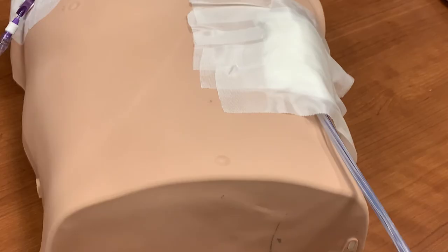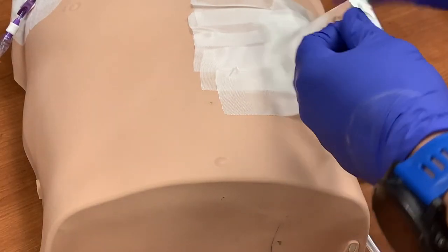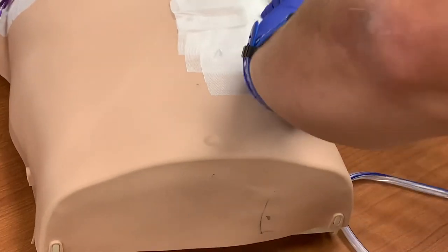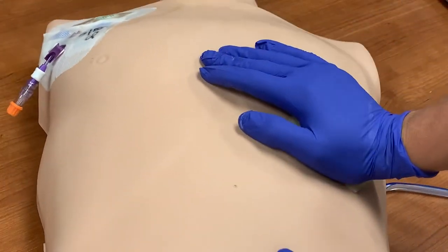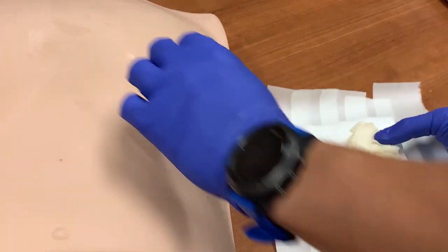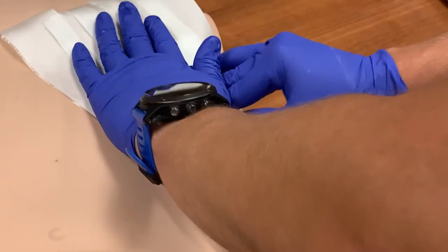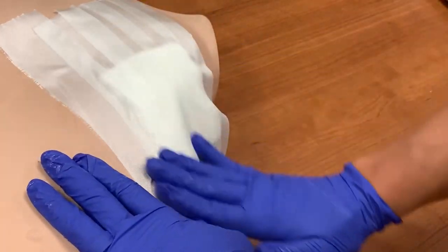It is possible that a chest tube could be accidentally pulled out as a patient moves around the room. If this ever happens, immediately get petroleum gauze and cover the entrance site with it, and hold firm pressure. We want to minimize the development of pneumothorax, and the petroleum gauze will act to seal the site from any air that could leak into the chest. Then, as someone else maintains the gauze, create a dressing just like for the dressing change — but instead of wrapping the tube with the petroleum dressing, the 4x4s will cover the large wad of petroleum gauze now covering the site. Contact the physician immediately, or if the patient is in distress, call a rapid response.